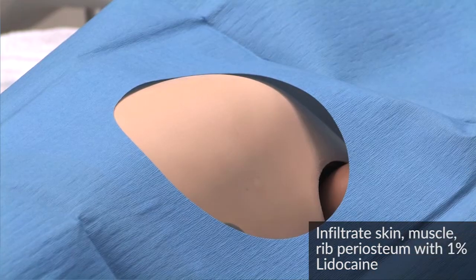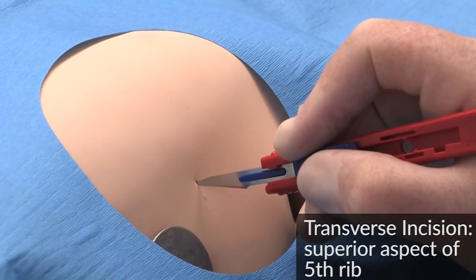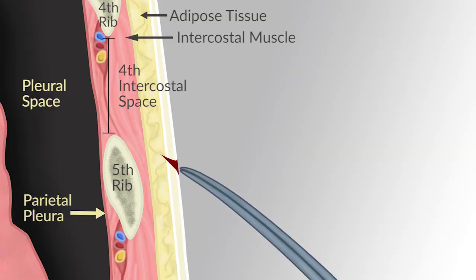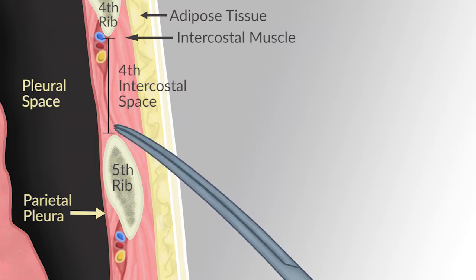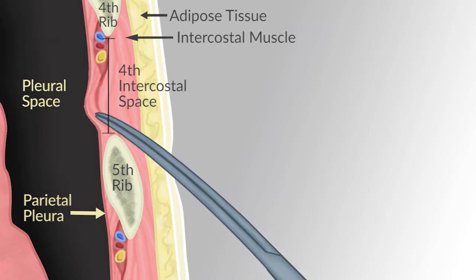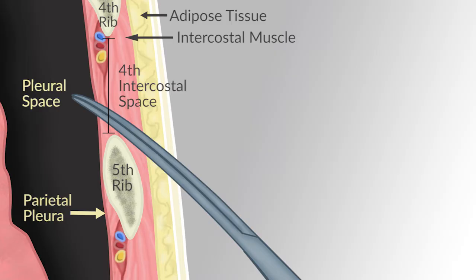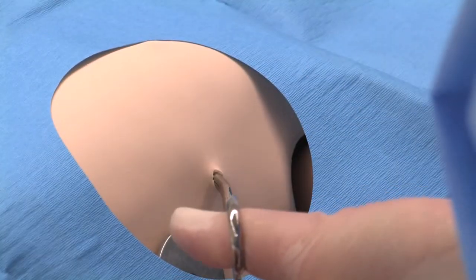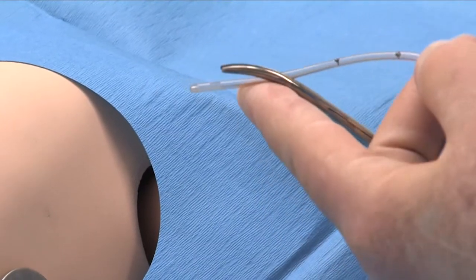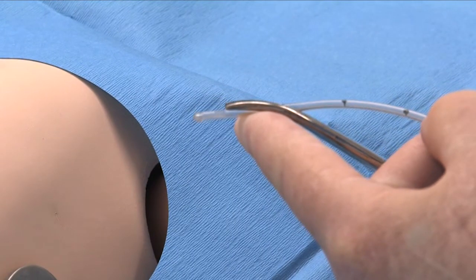Aspirate during insertion to be sure you are not in a blood vessel. Make a small transverse incision of 0.5 centimeters over the superior aspect of the fifth rib. Dissect the tissue with the Kelly clamp, tunneling to the fourth intercostal space. Close the Kelly clamp and apply pressure over the superior aspect of the fifth rib until the clamp punctures through the muscle and parietal pleura — appreciate a sudden loss of resistance. Enlarge the pleural opening by spreading the Kelly clamp open, then remove the Kelly clamp. Attach the Kelly clamp to the distal end of the chest tube, allowing the chest tube to extend just beyond the tip of the clamp. Trocar should not be used.